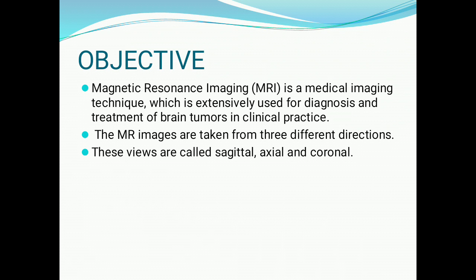These views are sagittal, axial, and coronal, and the brain tumor segmentation techniques are a critical component in tumor detection. Using machine learning techniques that learn the pattern of brain tumor is useful because manual segmentation is time consuming and susceptible to human error or mistakes.